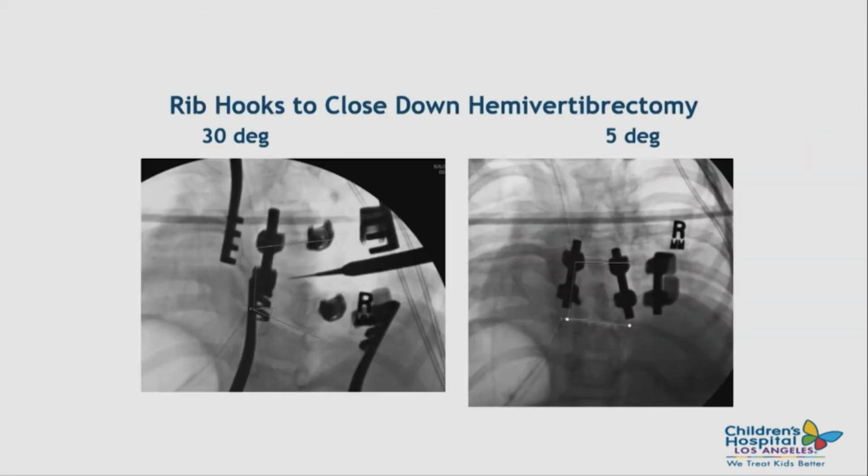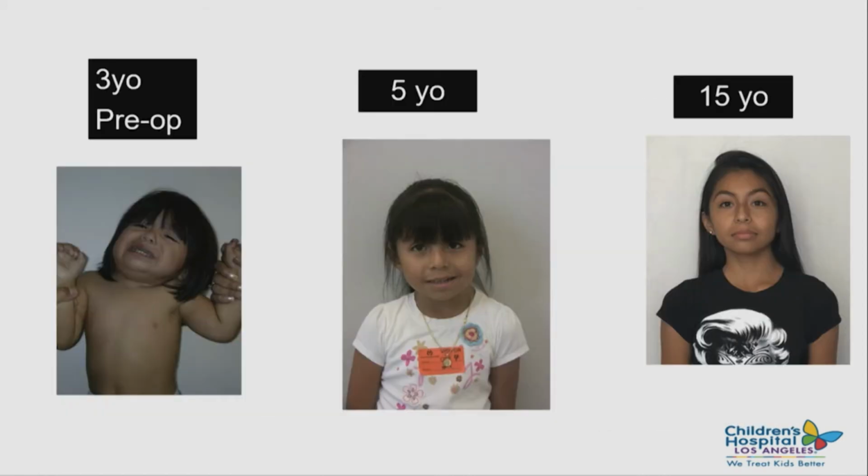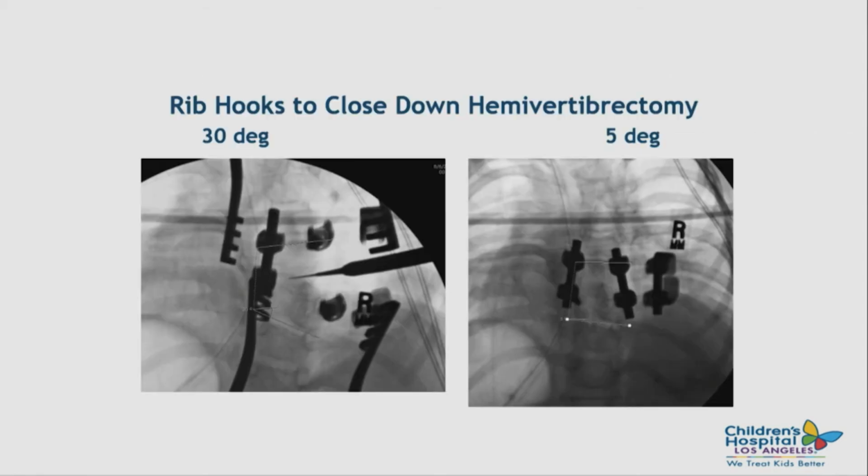So she came with her ear on her shoulder, and now, even though she has some scoliosis one way and the other way, you can't tell from looking at her. So I'd make the argument that was a very safe way to get a good outcome, and we didn't need to do something heroic like a VCR there. And this may be the last one.